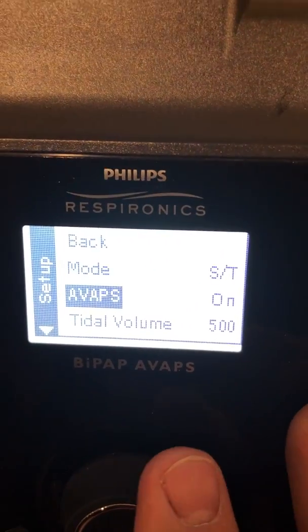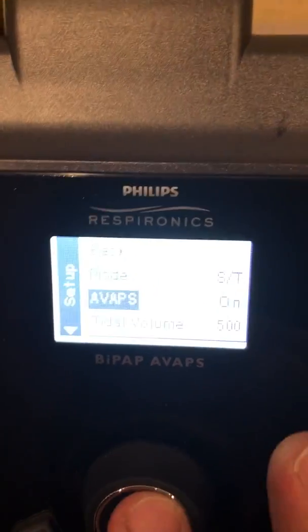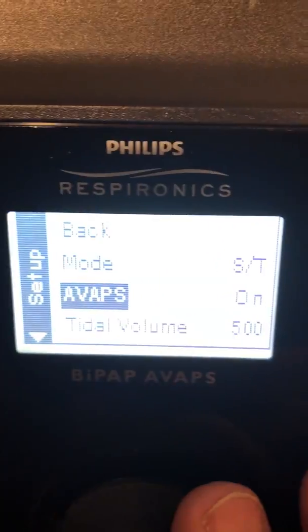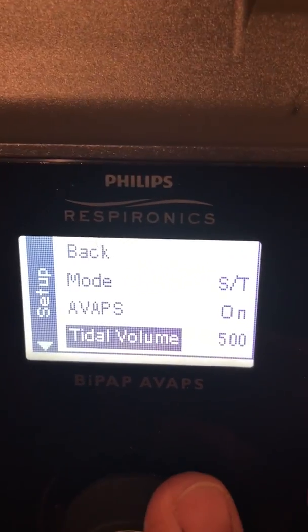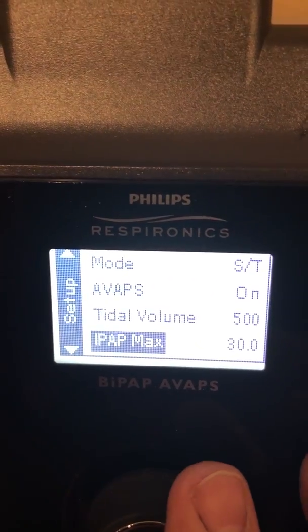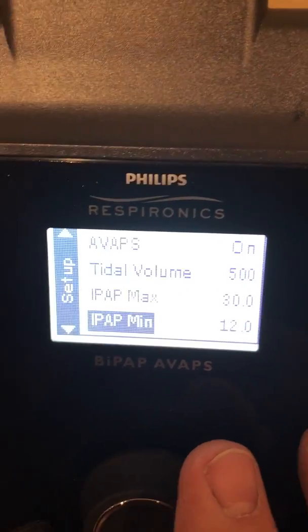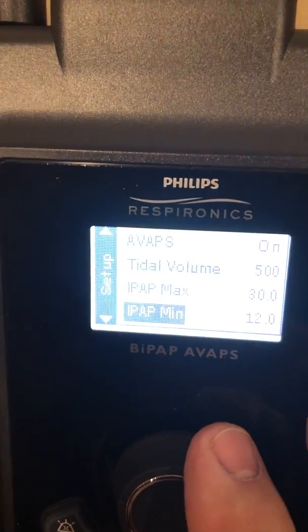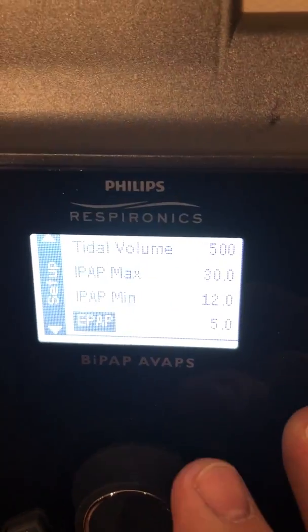With AVAPS, yes, we want that on. To make a change, we push the button, it'll toggle over, and then toggle back. Here's our tidal volume setting — a standard 500. We have an IPAP max of 30; we're going to utilize all the technology we can for this demonstration. IPAP minimum will be a standard of 12, which would adjust per the script, whatever the doctor ordered.